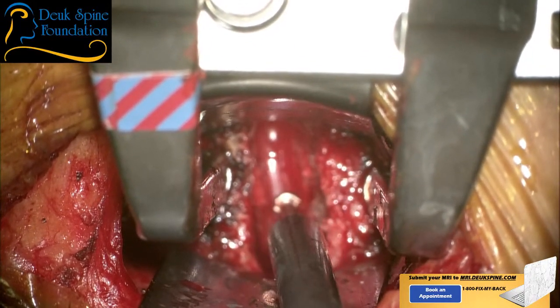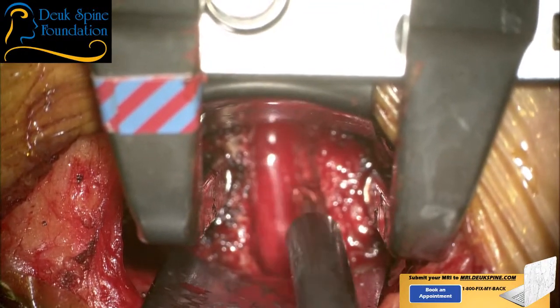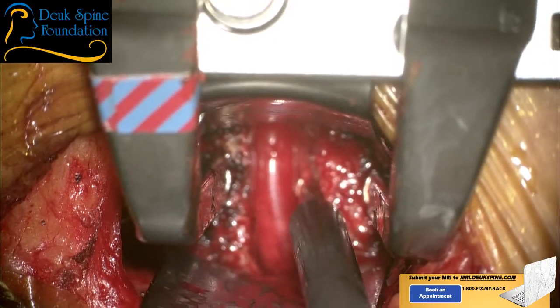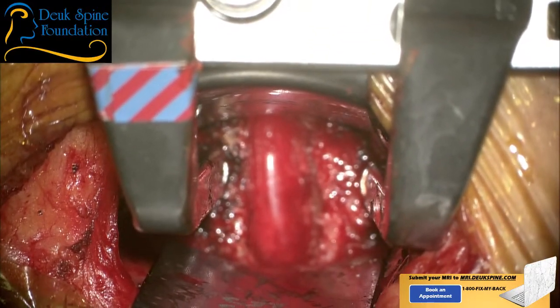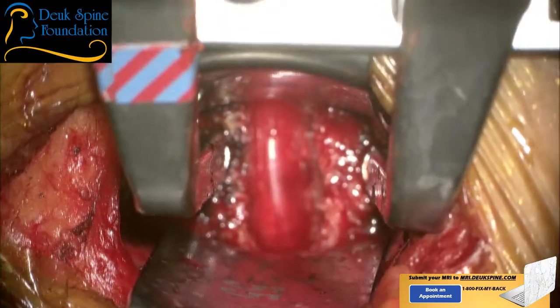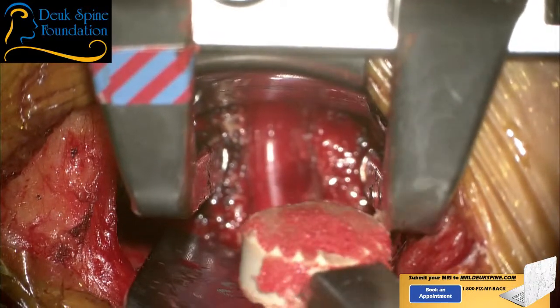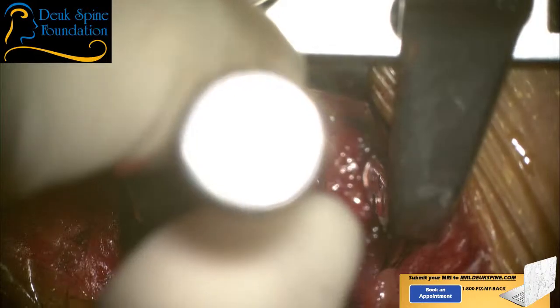I'm decorticating the center here, so it promotes bone growth. I want this bone to grow to this bone and attach to each other through here. So we're gonna fill the center of the cage with bone graft. Thank you, Luis. I'll show you so you can see what I'm talking about. It creates a bridge of bone graft. You see that? The cage is now filled with bone graft. We use a narrower cage.